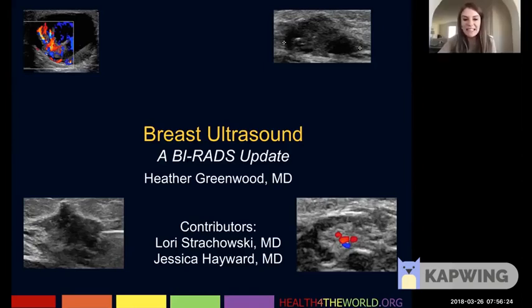Okay, good morning, everyone. I'm excited to be with you today to talk about breast ultrasound, and this lecture is going to focus on a BI-RADS update.